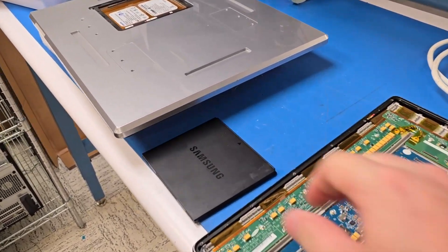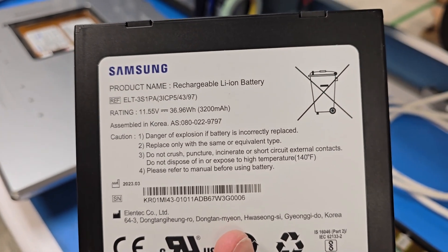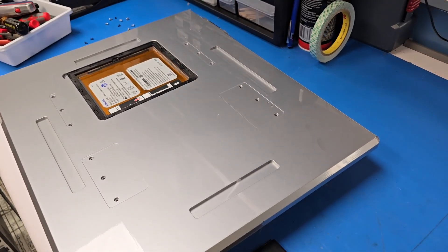Definitely a cool experience here. Look at this — we have 11.55 volts, 3200 milliamp-hours on the newer panel.